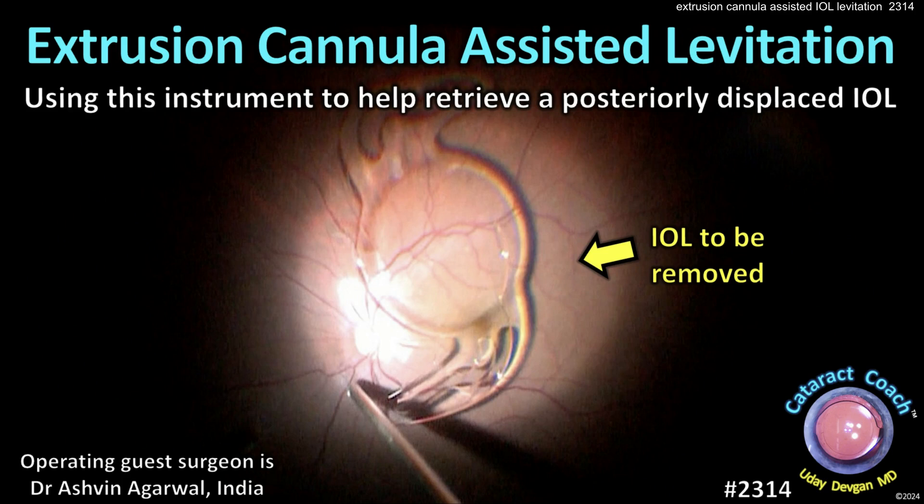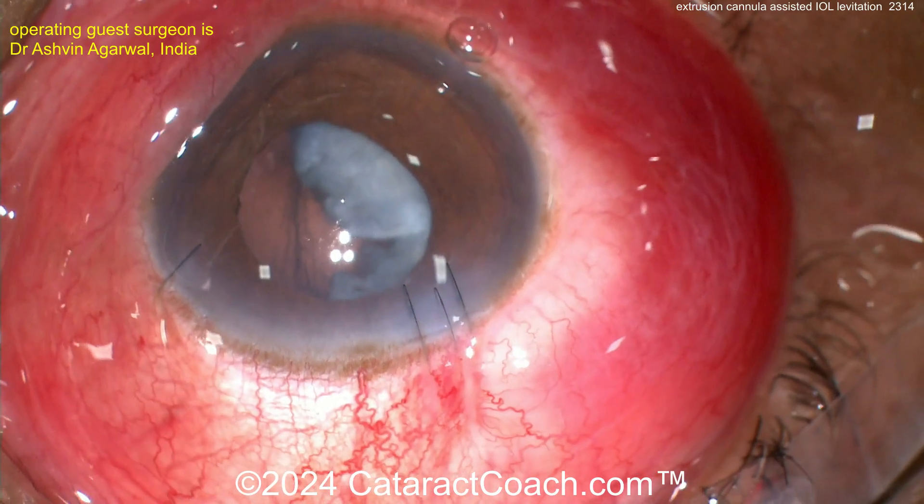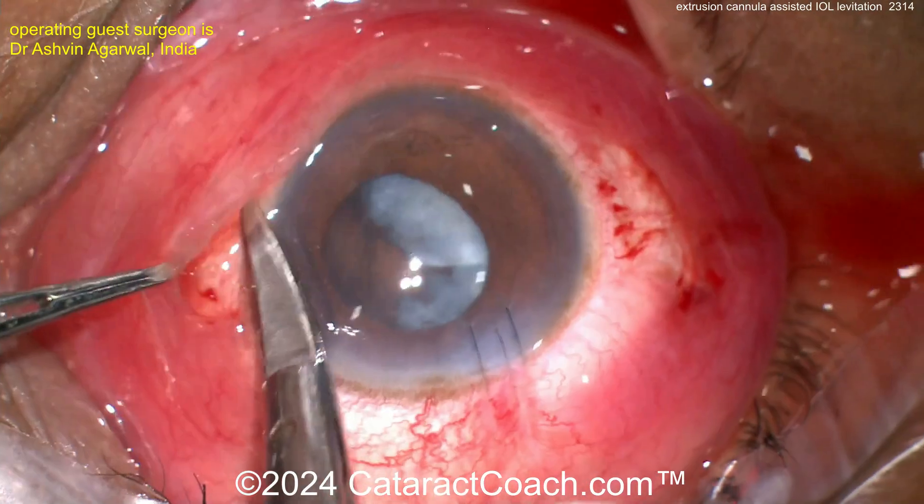CataractCoach.com — Extrusion Cannula Assisted Levitation. This technique uses the instrument to help retrieve a posteriorly dislocated IOL. The patient had cataracts done elsewhere and was referred in.